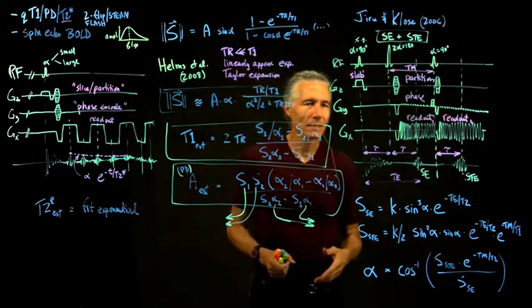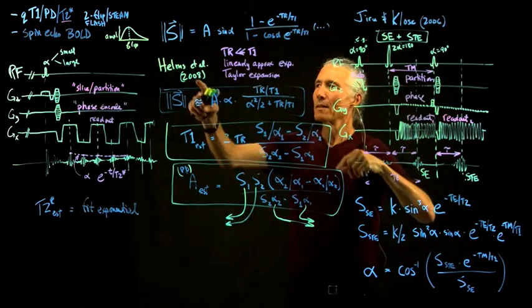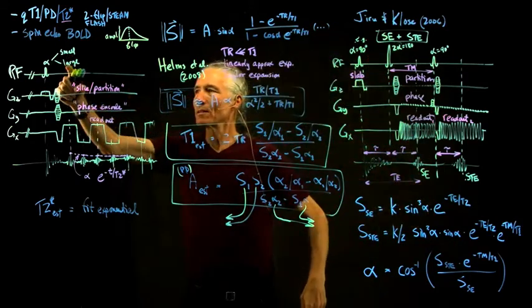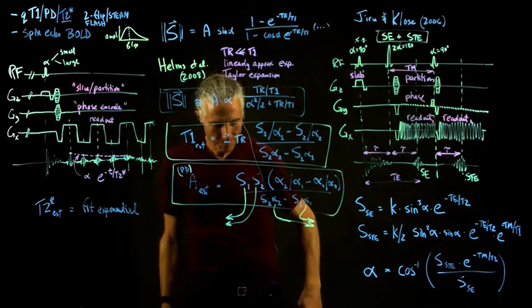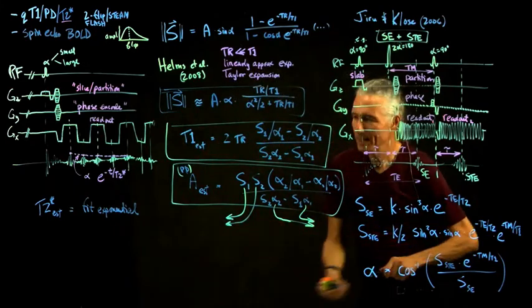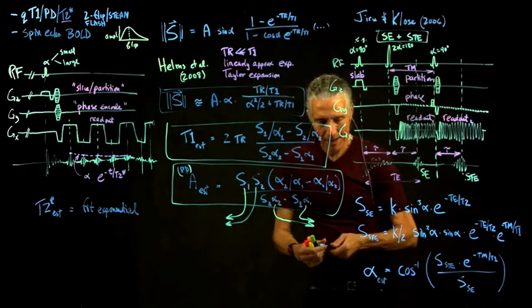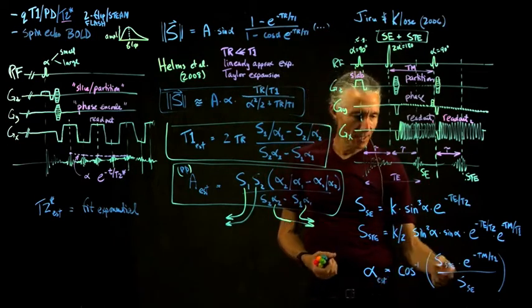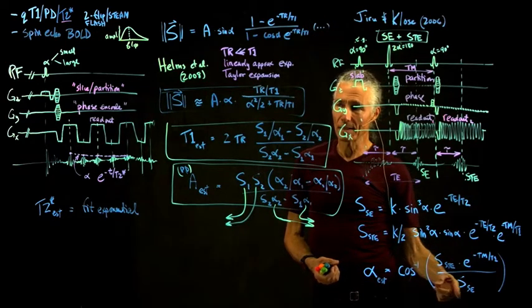So you could potentially do a second flip angle, a large flip angle and a small flip angle, and try to calculate the actual flip angle. So this is our estimated actual flip angle. And once we get that, voxel-wise, remember this signal, a stimulated echo and a spin echo signal, is at each voxel, and that's different in different voxels.